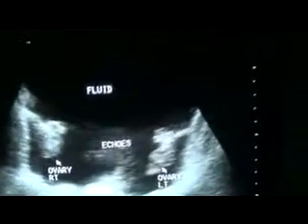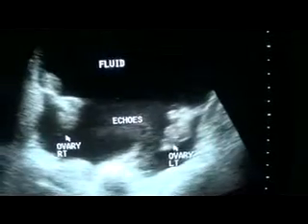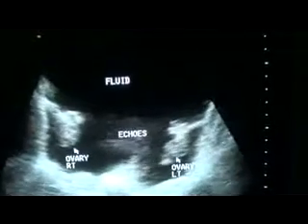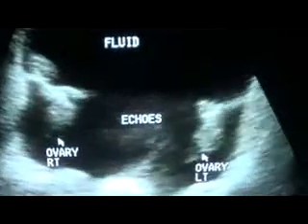And you can see there are echoes within this ascitic fluid. This segment was just to show you how you see ovaries, because the organs are studied beautifully in ascitic fluid or if there is fluid around. We see the pathologies in better detail.